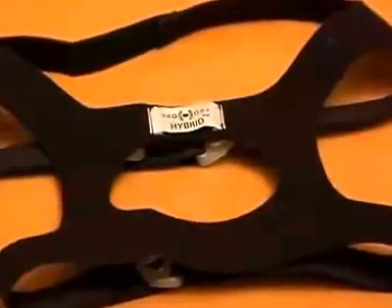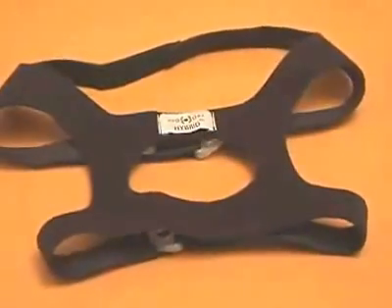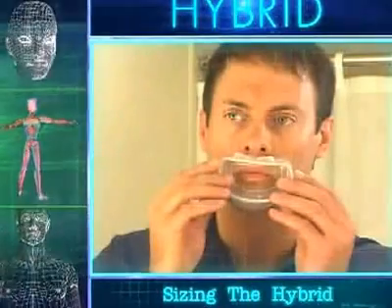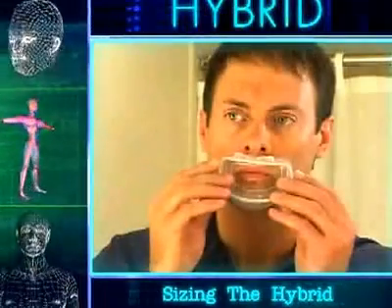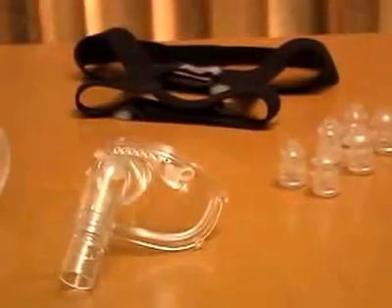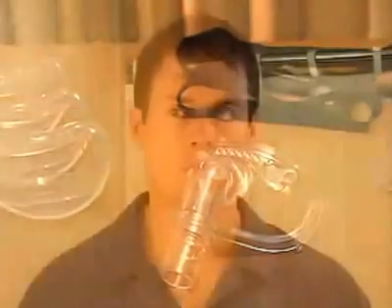Also included with the Hybrid is a premium headgear that has five points of adjustability to provide ultimate stability of the interface. To ensure your optimal comfort and safety when sizing and fitting the Hybrid Universal Interface, please follow the techniques provided in this video and in the instructions for use.